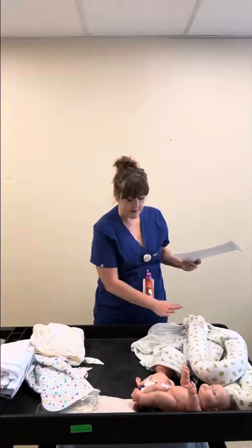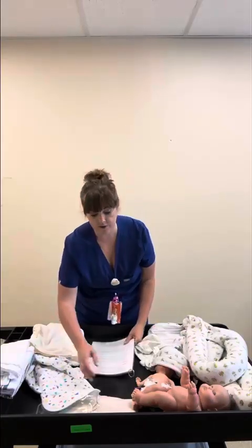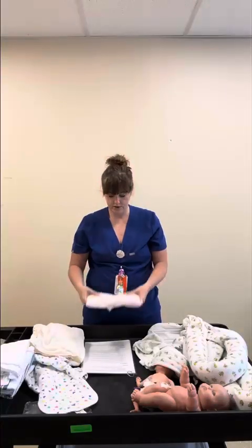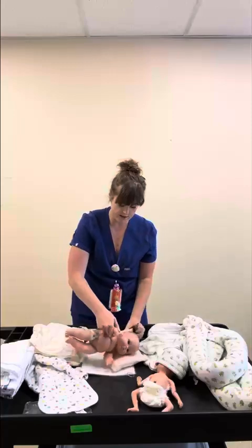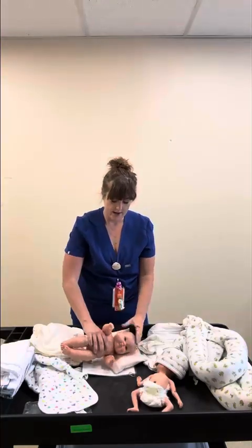You are allowed to use positioning devices like I mentioned before with an order. So if you've got a baby with plagiocephaly and they need to be positioned a certain way, the Z-Flow is a great device but does need an order. So you can kind of do this so that the baby is forced to look a certain way.